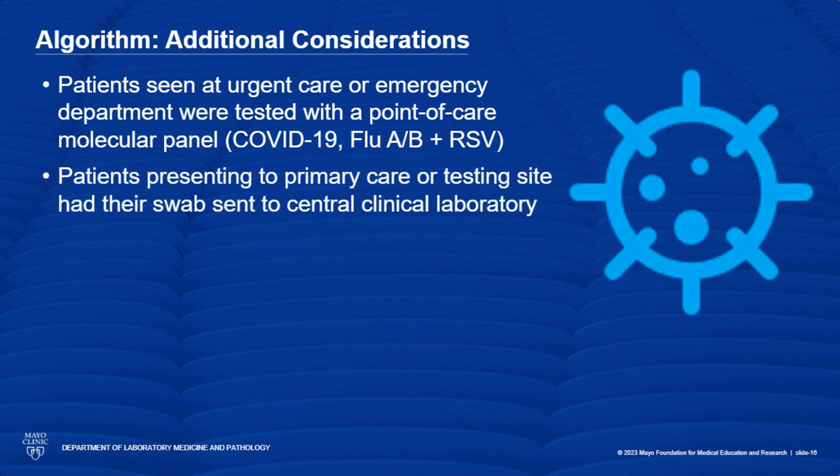Patients who were seen at primary care or went to one of our testing sites had a swab that was collected and was sent to our central clinical laboratory.